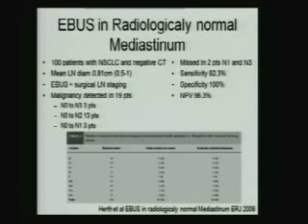So these are 100 patients with sub-centimeter lymph nodes and peripheral lesions, and they underwent EBUS followed by surgical lymph node staging. Malignancy was detected in 19 patients, so sub-centimeter lymph nodes, and 19 patients had positive lymph nodes by EBUS. The size of the lymph node was 0.5 to 1 centimeter with a mean of 0.8.